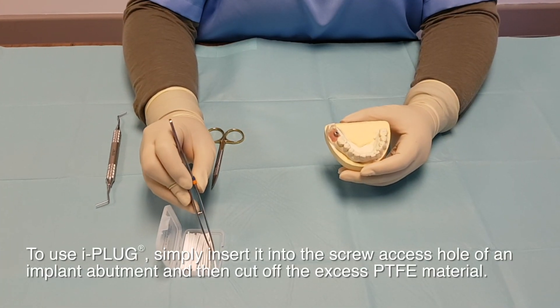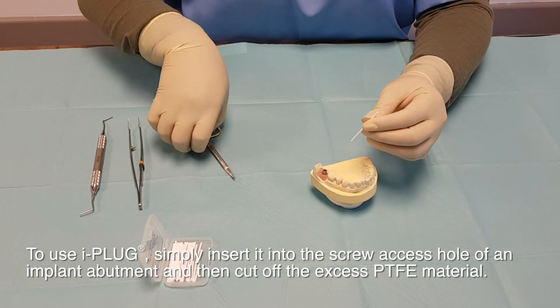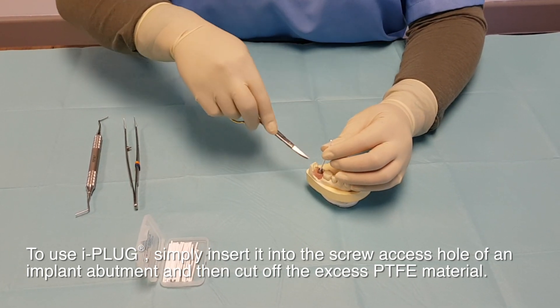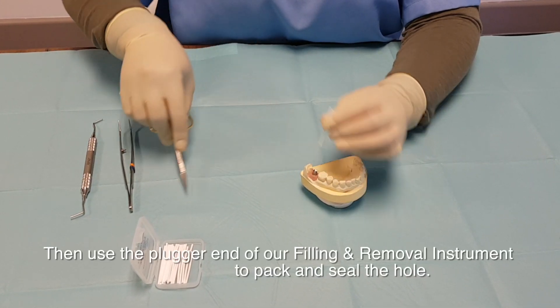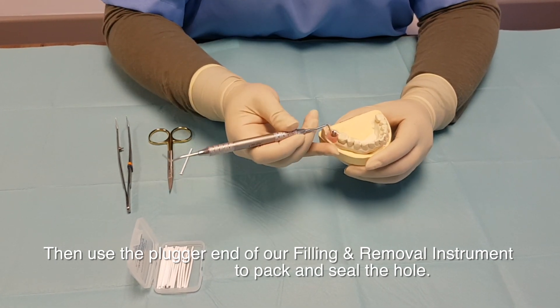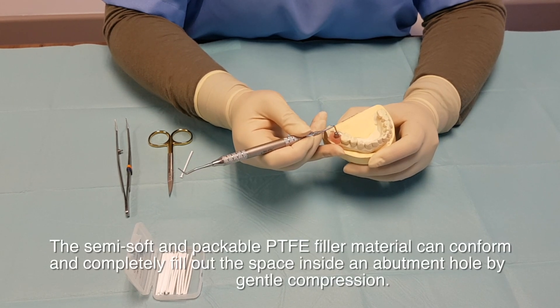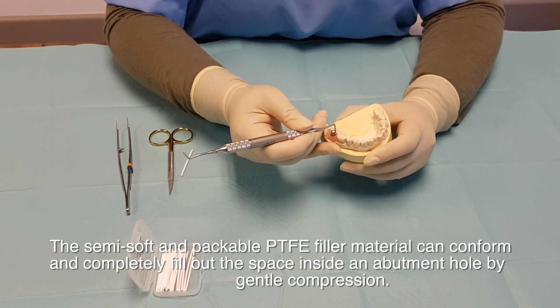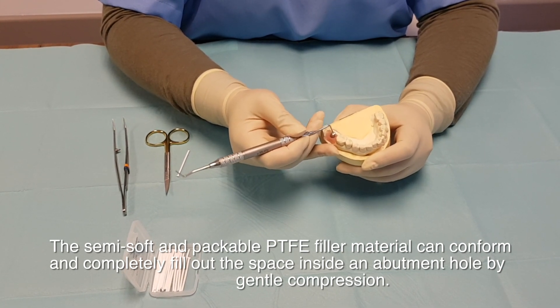To use iPlug, simply insert into the screw-axis hole of the implant abutment and then cut off the excess PTFE material. Then use the plugger end of the filling and removal instrument to pack and seal the hole. The semi-soft, packable PTFE filler material can conform and completely fill out the space inside the abutment hole by gentle compressions.